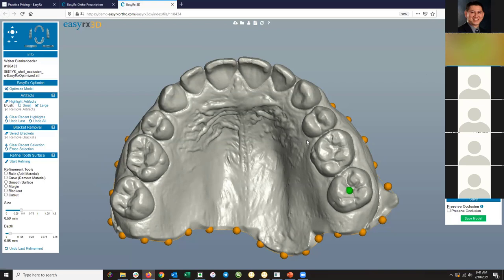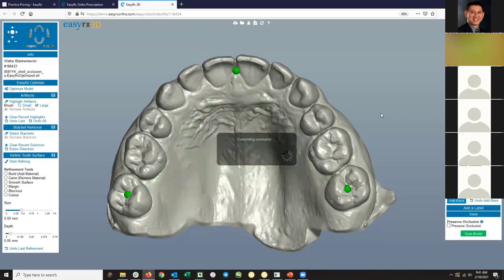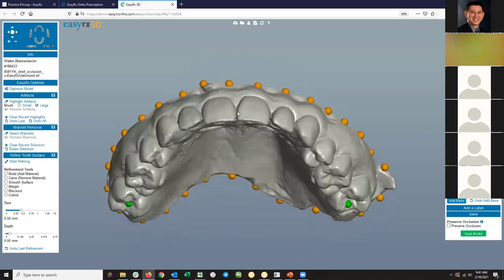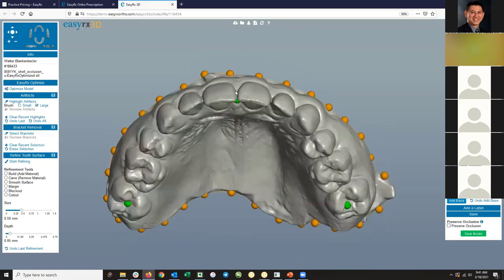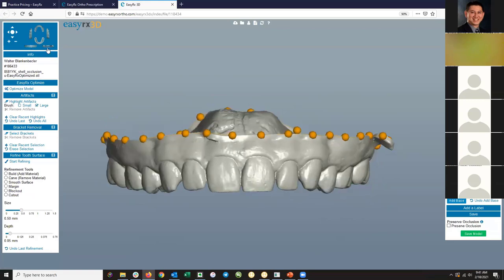We're going to click Orient Model, then click a point on the left molar, a point between the first anteriors, and a point on the right molar. After orientation, you move on to trimming. You can rotate the model by clicking on the surface and moving your mouse. There are quick view buttons on the left side to quickly see the front, back, or sides of the model. Now choosing your trim options - I'm going to do this in two steps, showing an easy way and then a custom way.